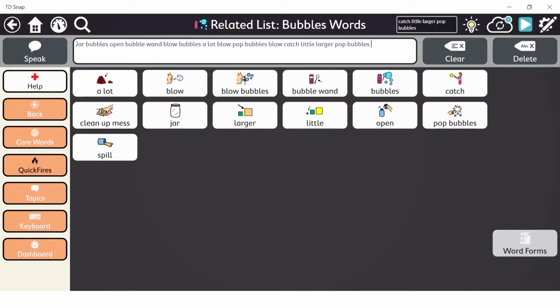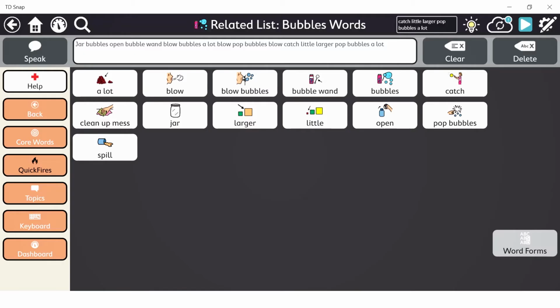And so as they say stuff, you need to respond to it. If they're like, a lot. Oh, you want a lot of bubbles? Okay, let's try to blow a lot. Or clean up mess. Well, I didn't make a mess yet. Hopefully I don't. But if I do, then yeah, I need to clean up my mess. And so just respond to what they're saying as they're learning to use these buttons.